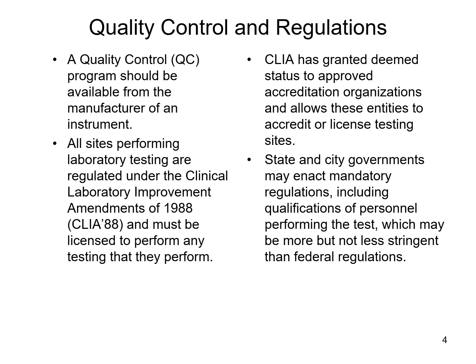Now, just like any test that's done in the lab, any test done outside of the lab also has to have a quality control program available, and it's usually based off of what the manufacturer for that particular test kit or analyzer says for that particular analyte.